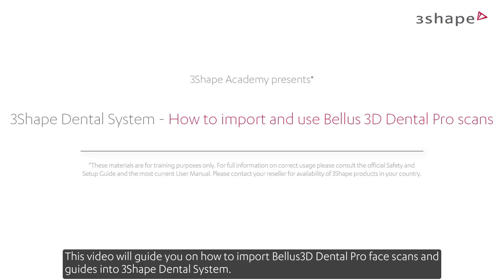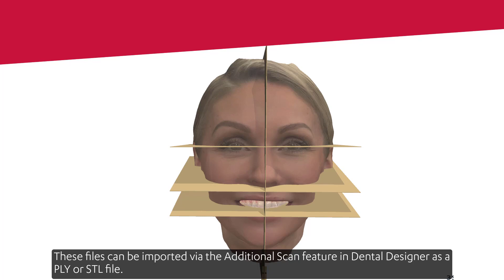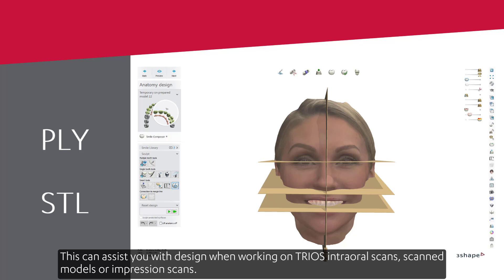This video will guide you on how to import Bellis 3D Dental Pro face scans and guides into 3Shape Dental System. These files can be imported via the additional scan feature in Dental Designer as a PLY or STL file. This can assist you with design when working on TRIOS intraoral scans, scanned models, or impression scans.